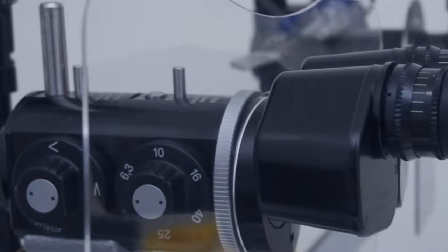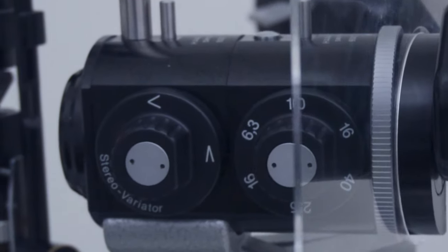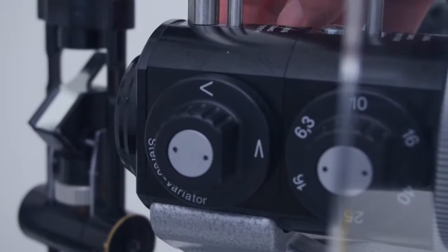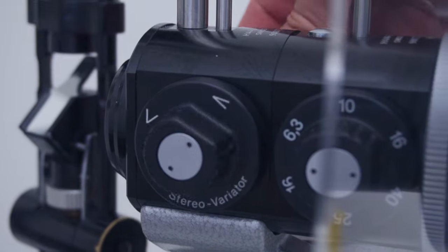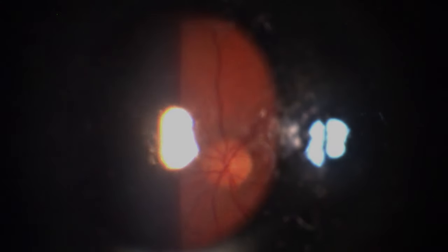The stereo variator is usually mounted as the front part of your slit lamp and can be set to wide or narrow. It greatly improves your fundus exam by reducing reflections and increasing contrast. So let's see how it works.